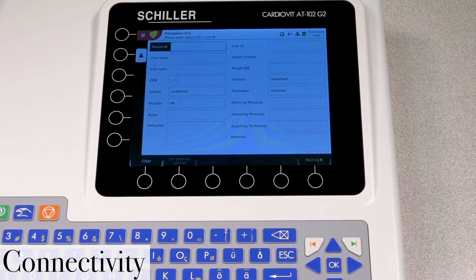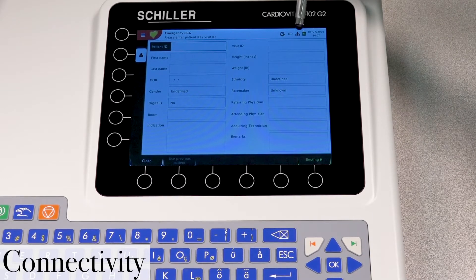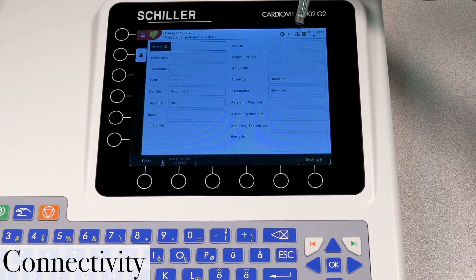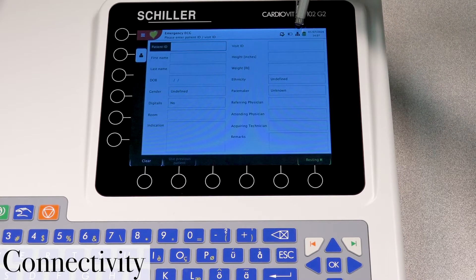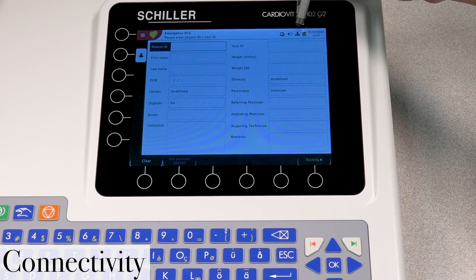So the first thing you want to look at is this icon here at the very top. Now this icon will let you know whether or not you're connected either to a Wi-Fi network or to the server or if you're not. Now in this case, if you notice, you have an X here. Now that X indicates that you're not connected to anything.